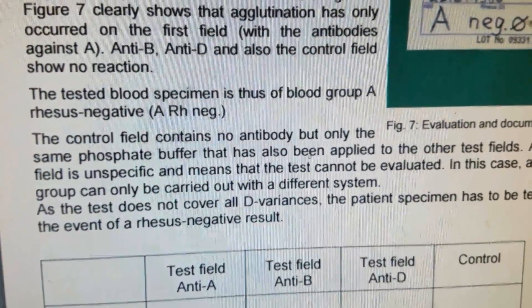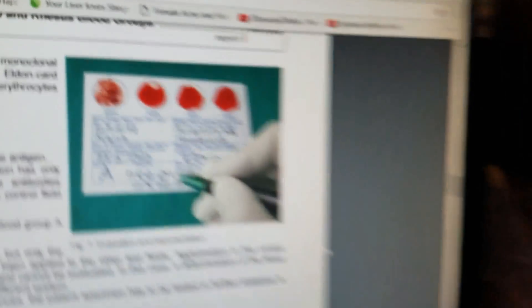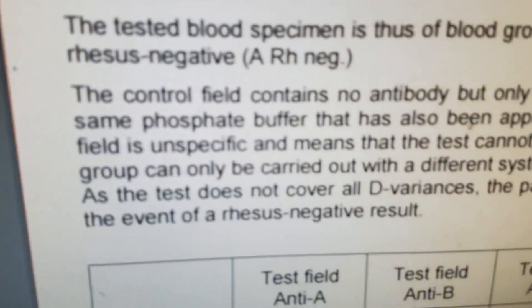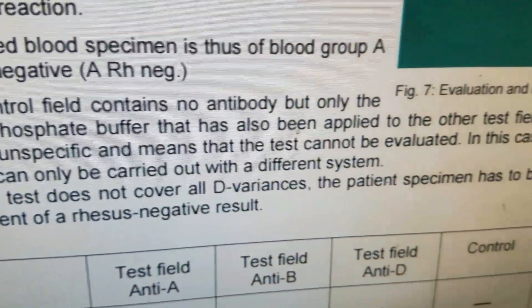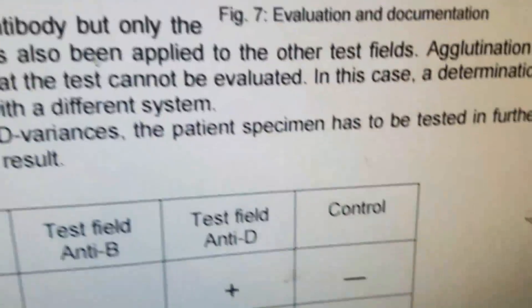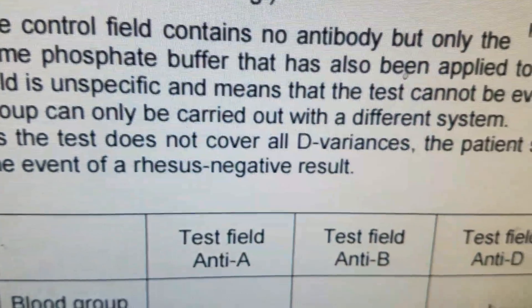However, the control field — the far one — is all agglutinated. When that happens, the control field contains no antibody, but only the same phosphate buffer that has been applied to the other test fields. Agglutination in the control field is unspecific and means the test cannot be evaluated. In this case, a determination of the blood group can only be carried out with a different system.